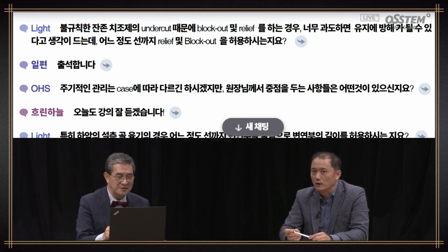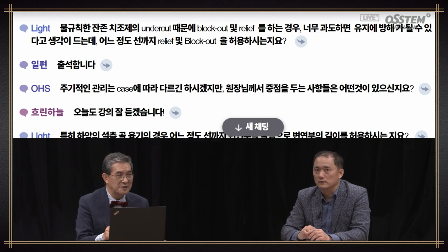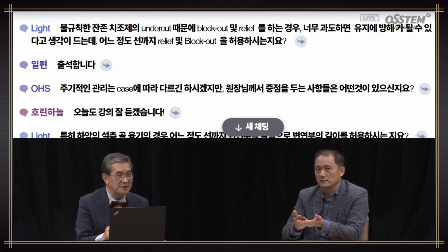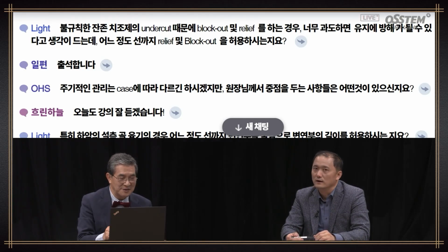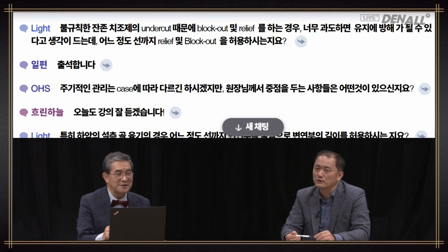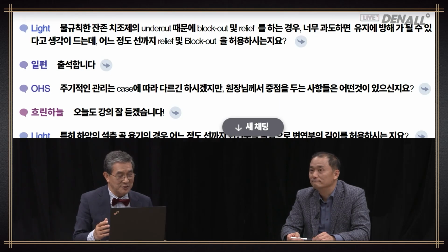So consider all that. But in most cases, if there is a hindrance, the patient complains of pain at the gingiva and there could be bleeding. So until that is resolved, you have to do a relief. You put it in and out, and you see how much the patient can endure.